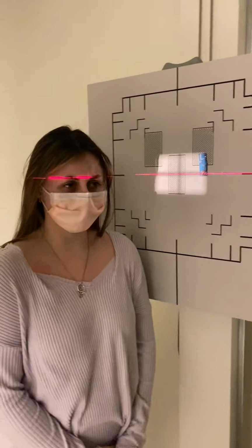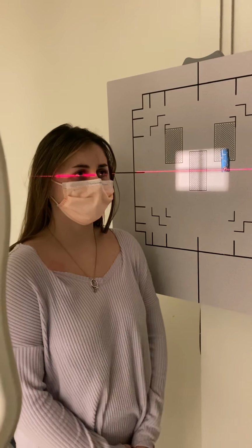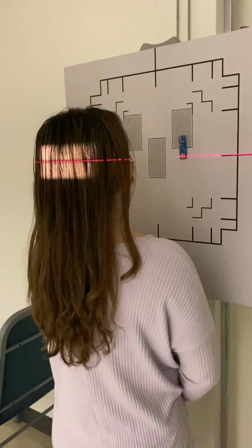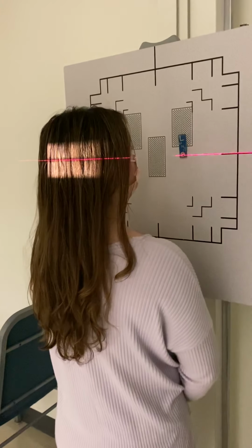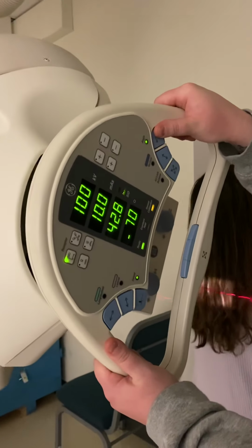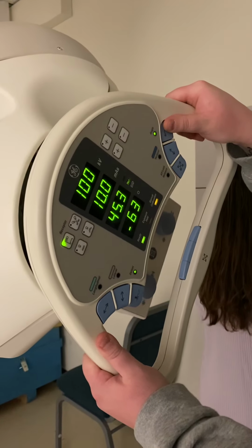So the next projection I've got is the PA axial. I'm going to make a caudal angle of 30 degrees with my tube. Bring that down to 60.